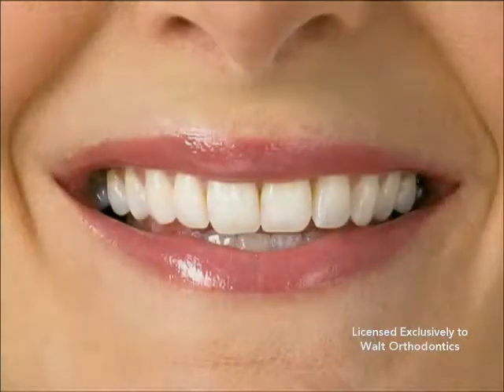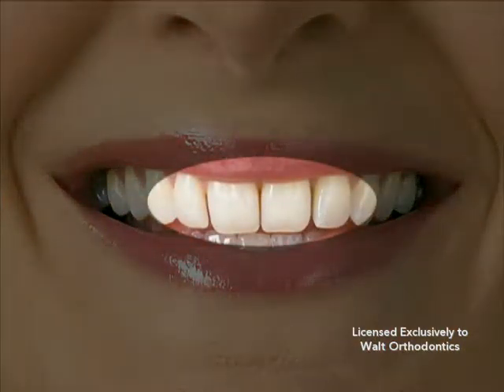Interproximal reduction, IPR, also referred to as stripping, reproximation, or slenderizing, is the process of reducing tooth size to better align and reshape teeth.